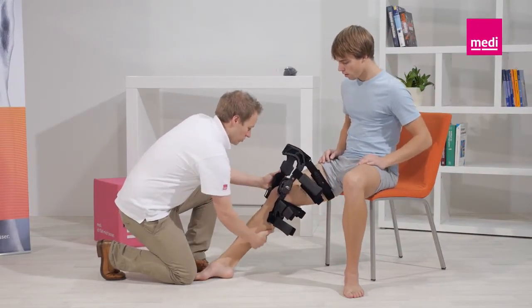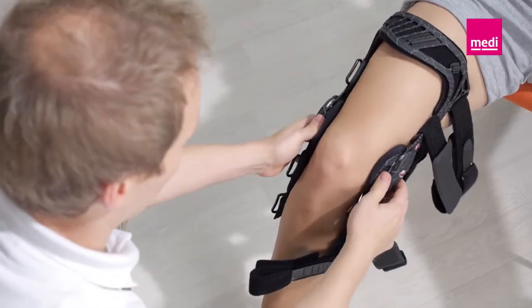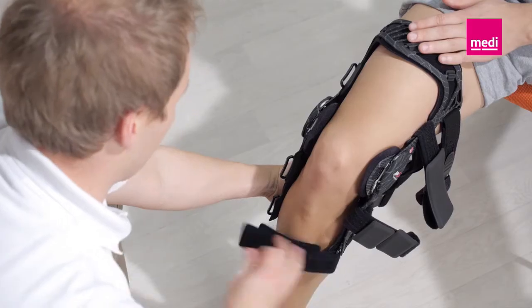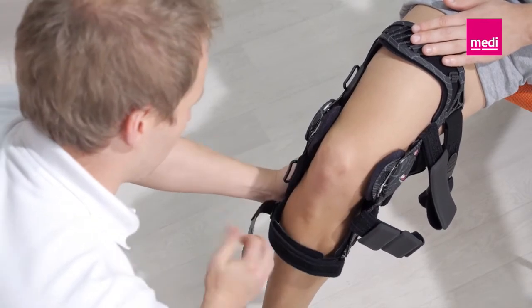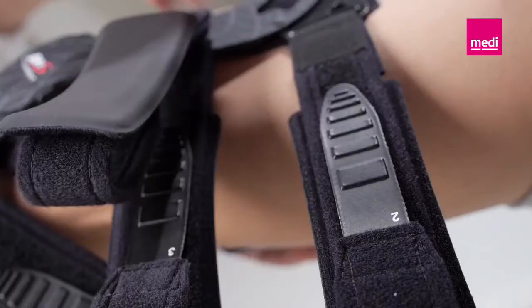It's best if the patient sits on the edge of a chair. Pull the orthosis over the leg and bend the knee to 45 degrees. Position the orthosis so that the middles of the hinges are at the level of the superior border of the kneecap. Make sure that the orthosis is not twisted on the leg. The straps should be secured in the order specified by the numbers to guarantee the orthosis fits securely and has the optimum effect.